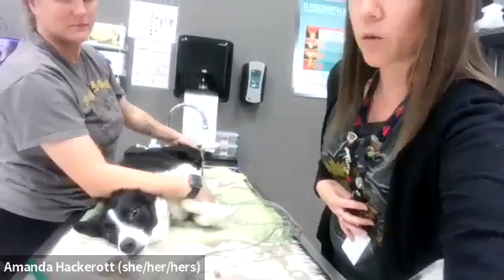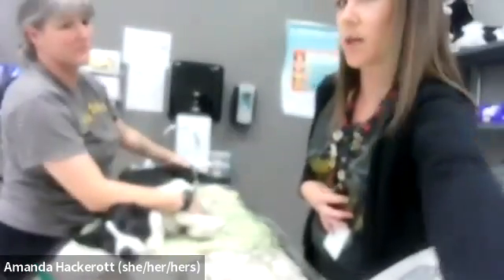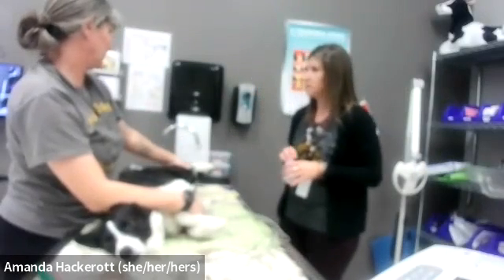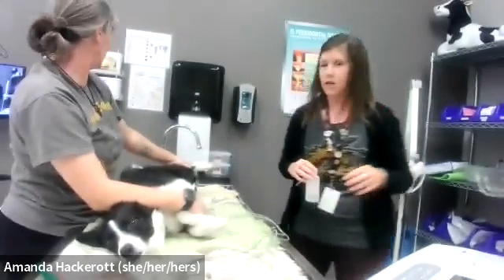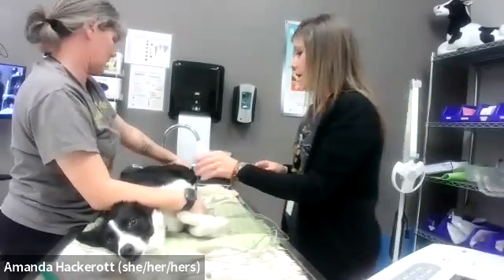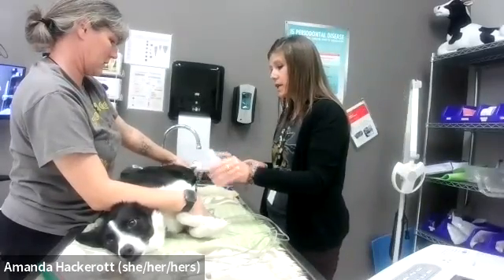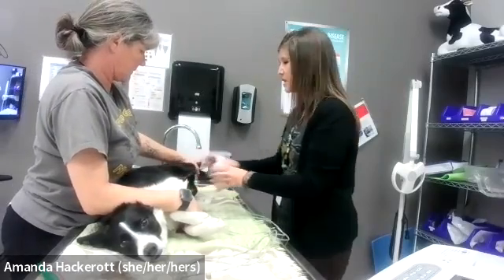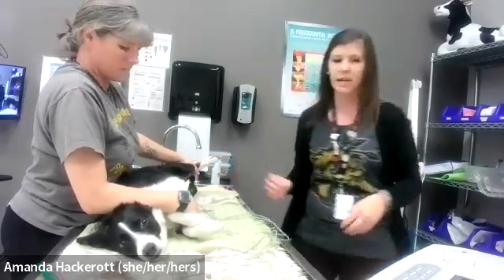Now what we have to do in order to run our EKG is to place some alcohol over our leads to help with electrical conductivity. This is sometimes the part that the animal doesn't like.